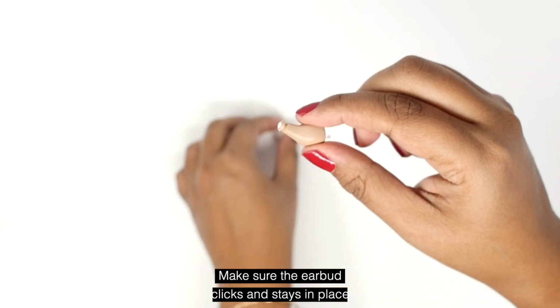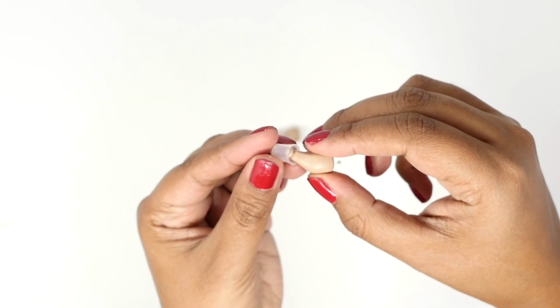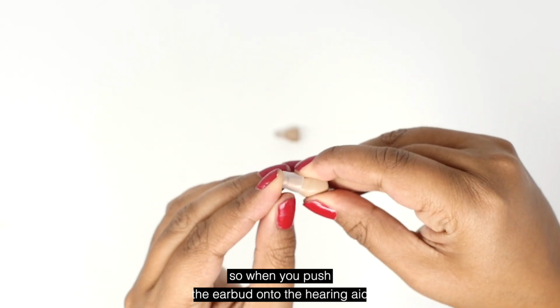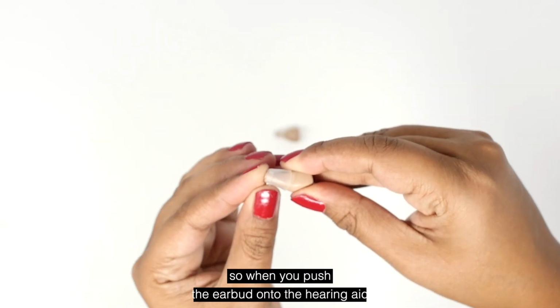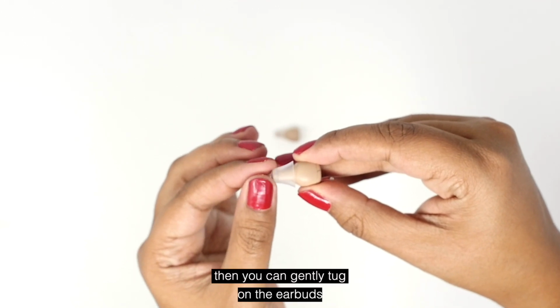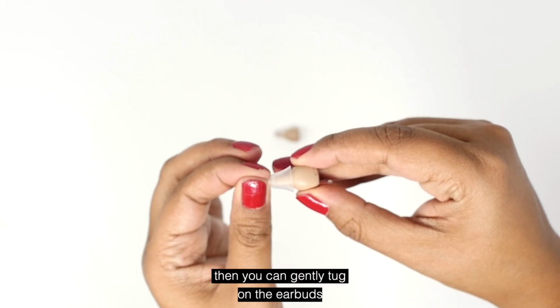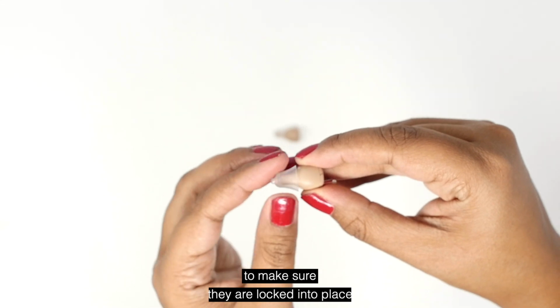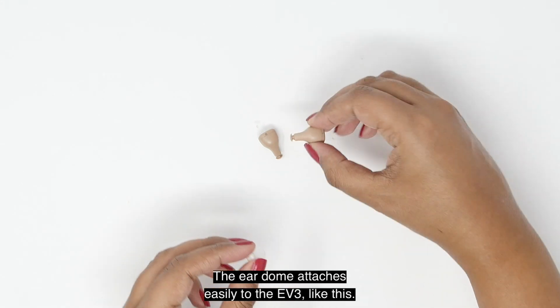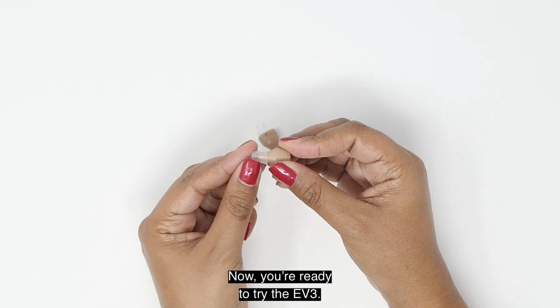Make sure the earbud clicks and stays in place. Smaller earbuds are harder to put on, so when you push the earbud onto the hearing aid, you should feel a slight click into place. Then, you can gently tug on the earbuds to make sure they're locked into place. The ear dome attaches easily to the EV3, like this. Now you're ready to try the EV3.